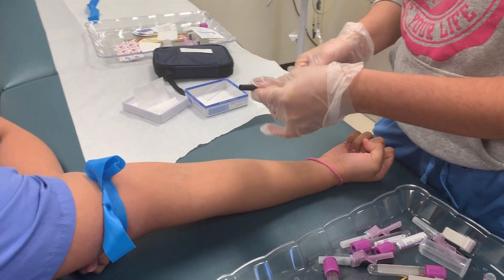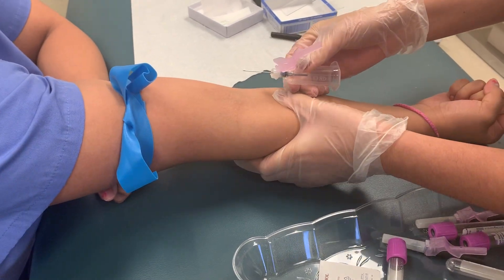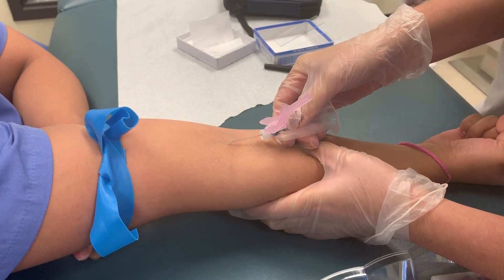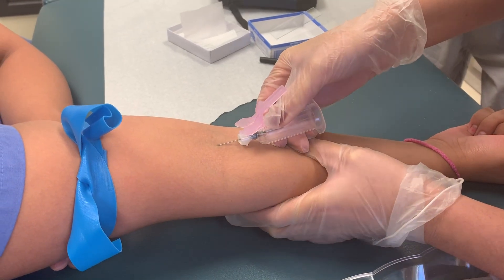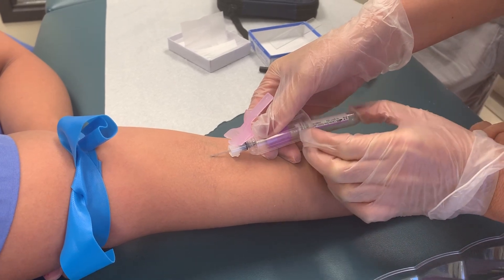Okay, you can go and cut the vein. Yes, go in the middle. Yes. Good. Yes. Take the tube. Insert the tube.